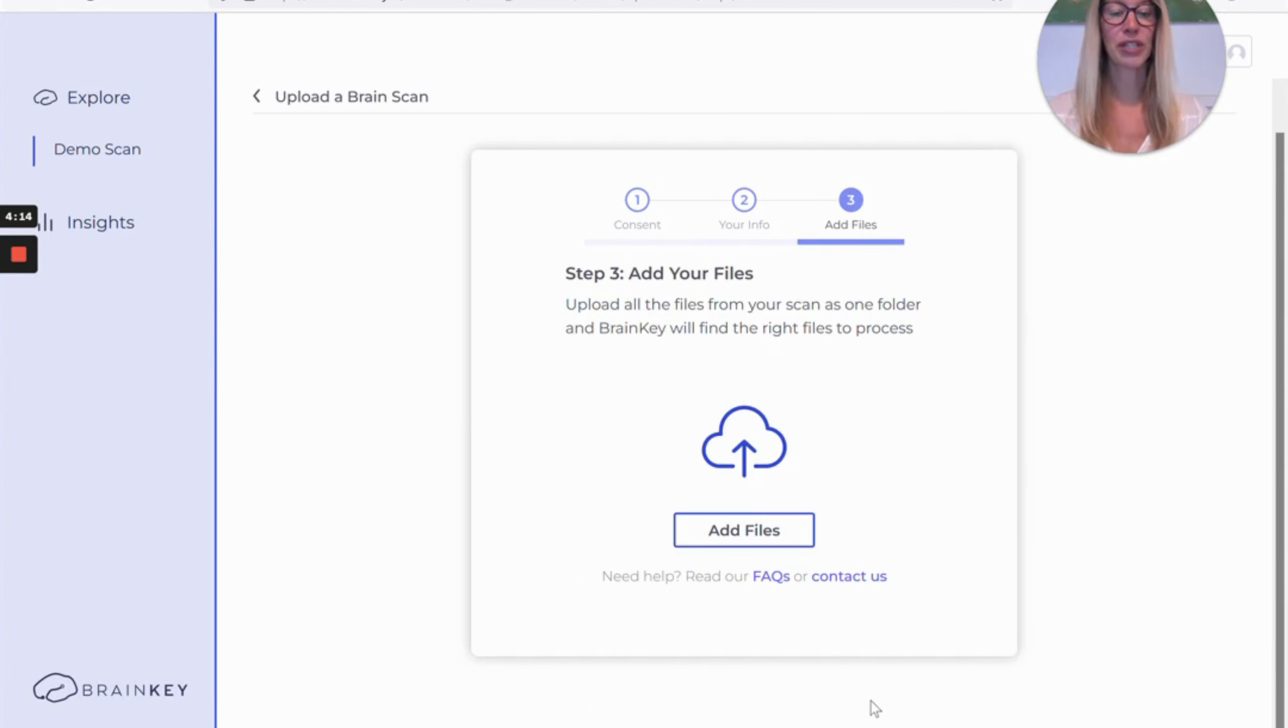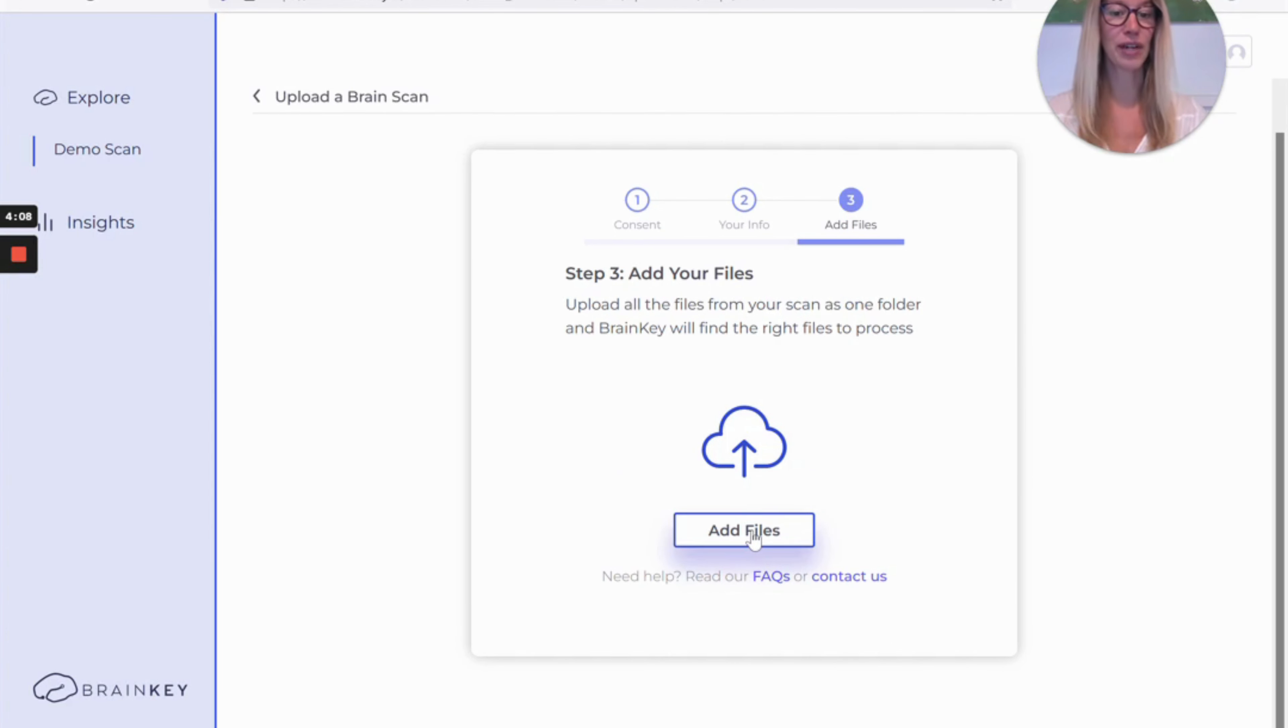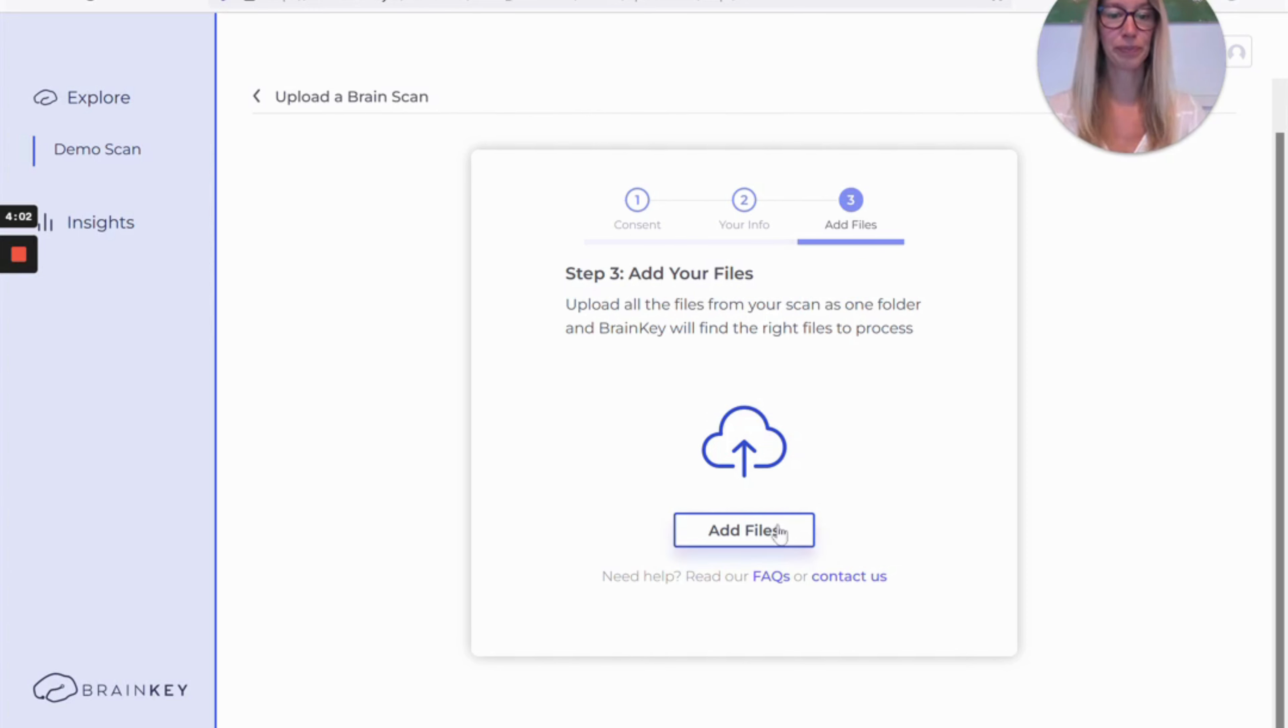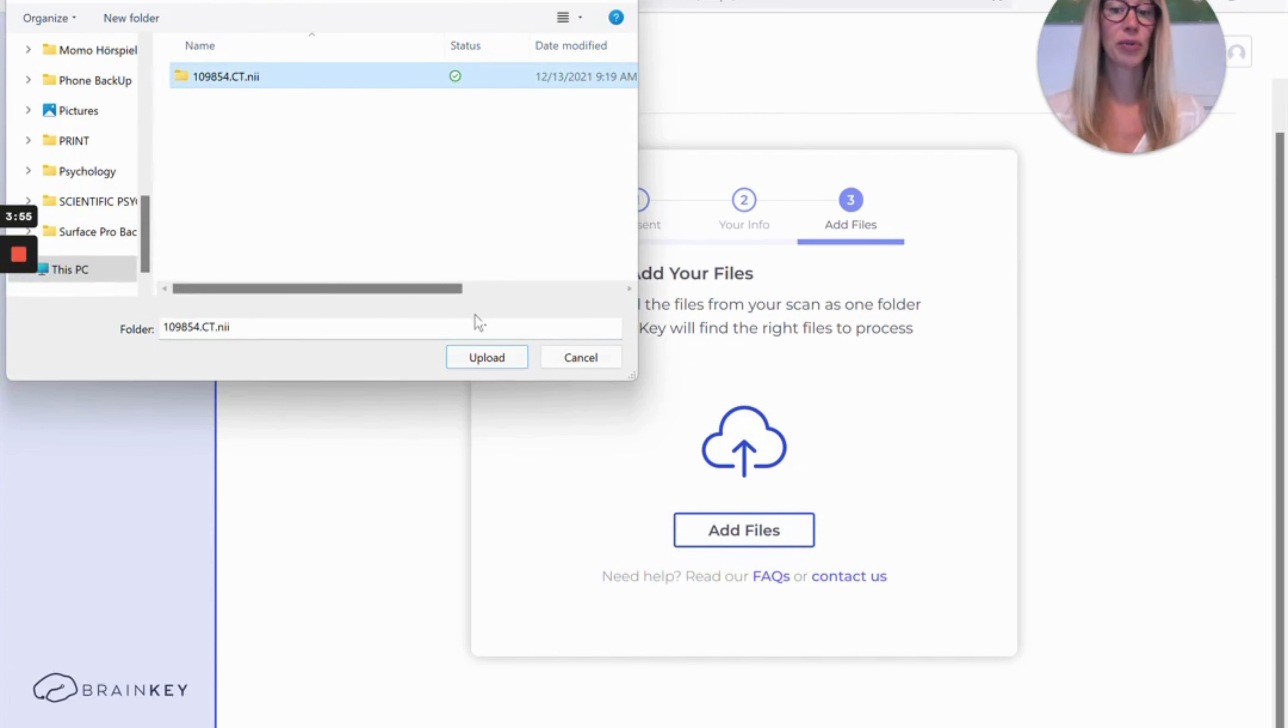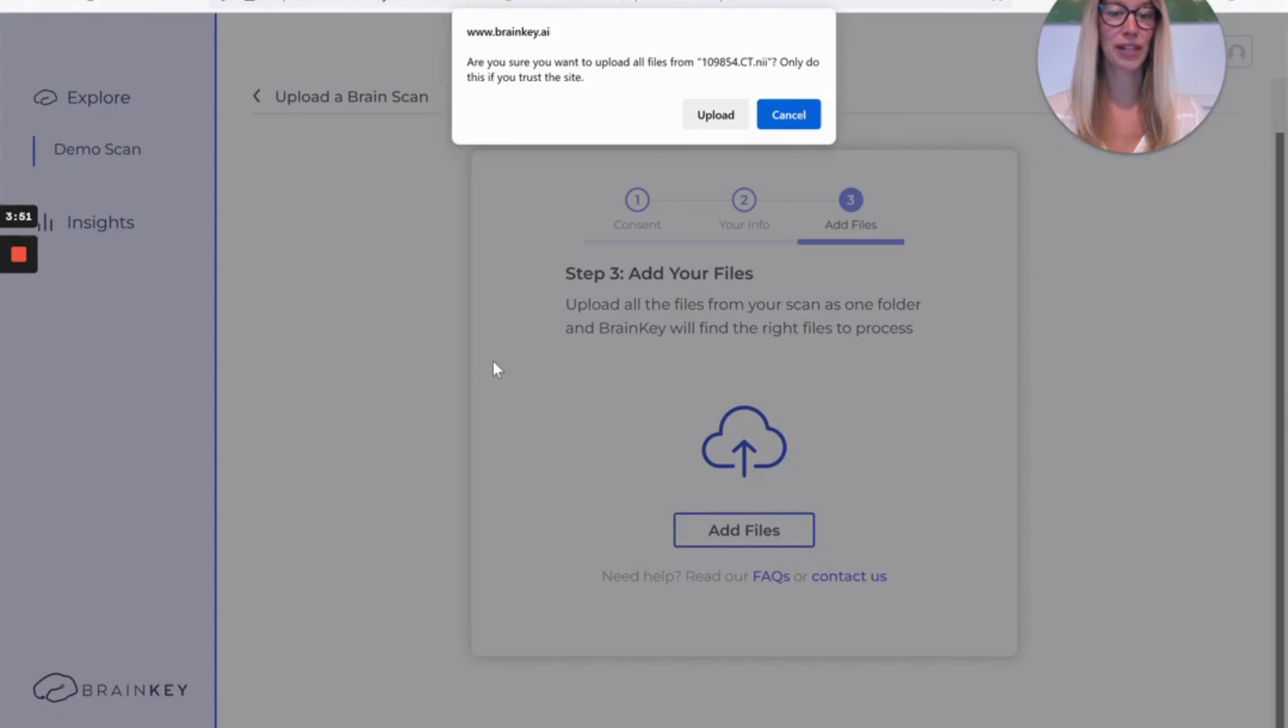And then you upload your scan. To do so you can either click add files and select the main folder with all your scan files or you can grab this folder and drag and drop it to this field. So I'm going to click add files and I'm going to find my scan and importantly again select the main folder here so we don't miss any files to process and upload.